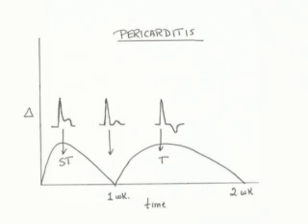Prior to the era of modern imaging and cardiac marker studies, etc., the distinction of pericarditis often required serial tracings and the evolution that's distinct and different from that of ischemic injury. With pericarditis, you'll have ST segment elevation, usually for about a week or so. The ST segment goes back down, but it doesn't flip the T wave over. And of course it doesn't cause Q waves. But the ST segment comes back down and you have a period where it looks normal.